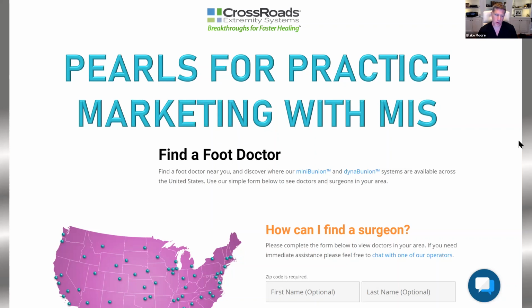And it's dependable. Having the plate sit interosseous and then having the capital fragment rotational control sit on the medial cortex gives you both axial stability and rotational stability. So I have a lot more confidence that wherever I put that correction, it's going to stay there until it's healed. And so that's one of the reasons why I prefer this system.